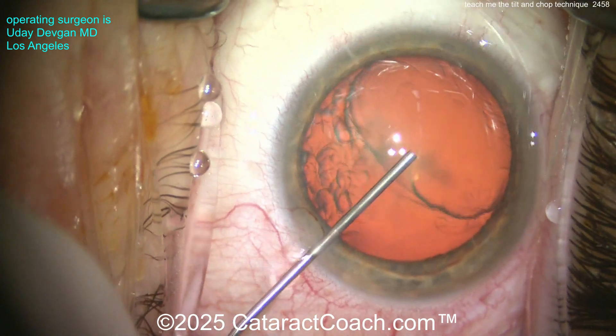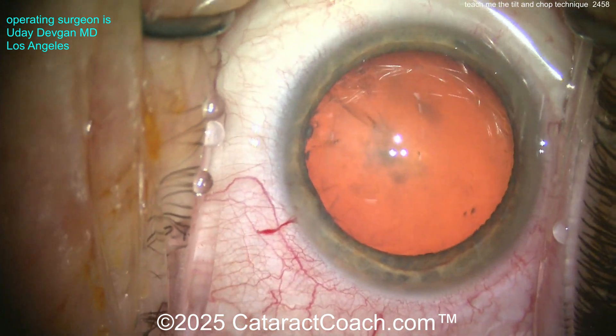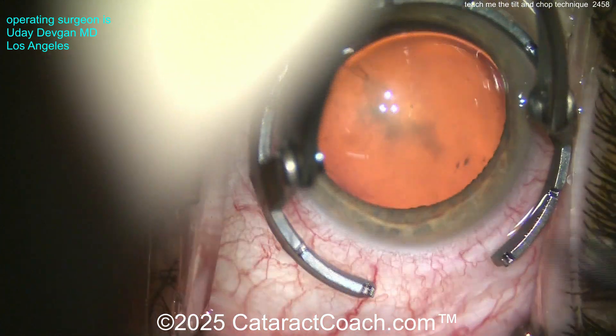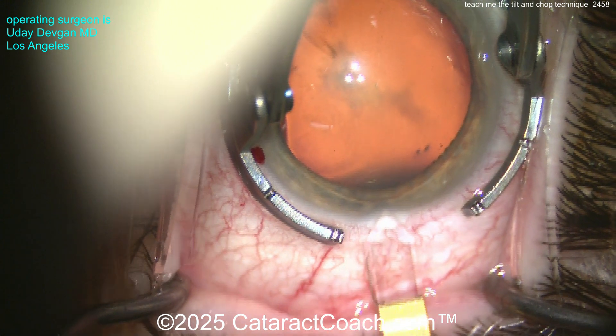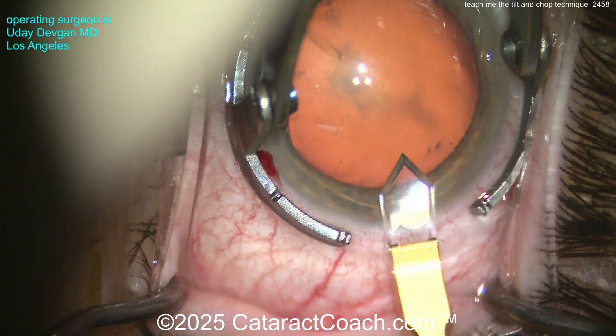Here's our fill with our dispersive viscoelastic, getting a good coating of the endothelium. Now time for the main incision — here comes the keratome. Diamond keratome for me, because I'm fancy like that. Creating that incision single plane, nice and easy, getting the dimension that I want.